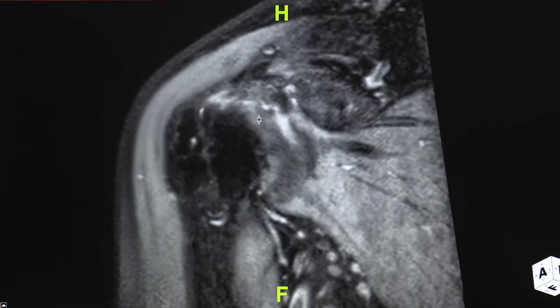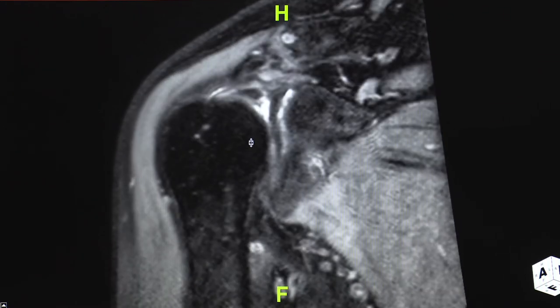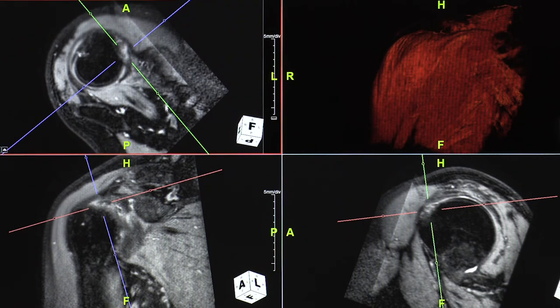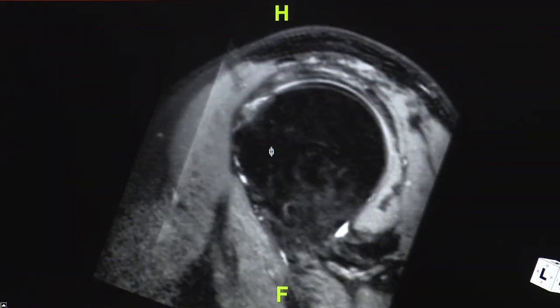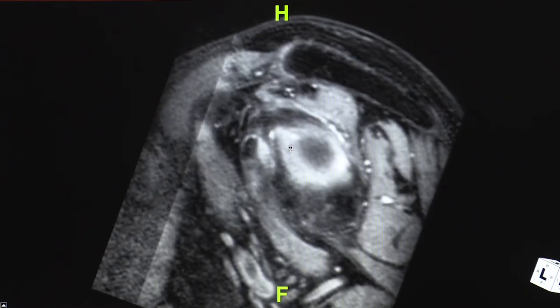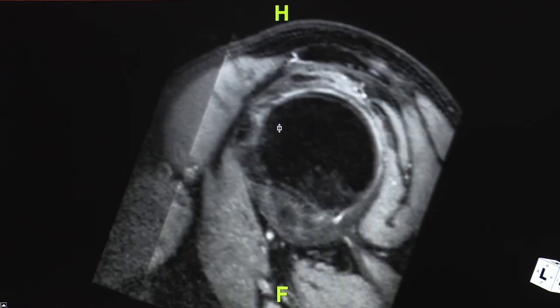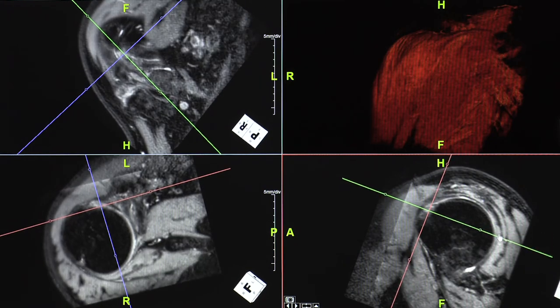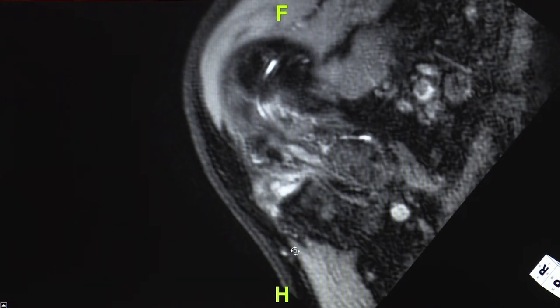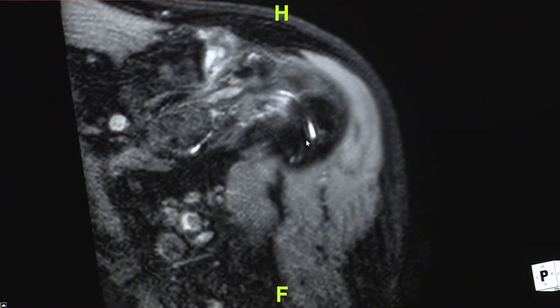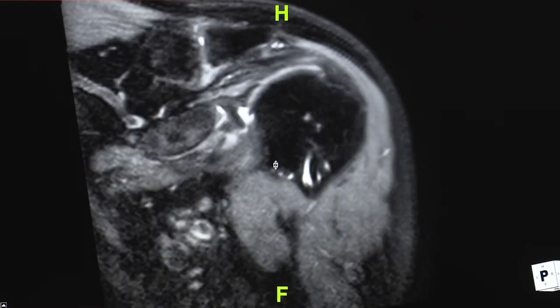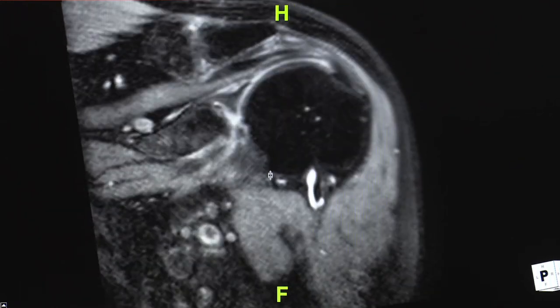You can evaluate the rotator cuff too. The biceps tendon is visible there — the horizontal portion is the hardest part to see on 2D images. To see it, bring the image closer to the horizontal part and straighten it, then scroll through to see the horizontal part coming into the labrum. The horizontal part is abnormal. You can rotate in any plane to see it — the longitudinal portion is okay, the genu is mildly abnormal, and the horizontal part is quite thick and tendinotic, helping the surgeon make decisions about tenodesis.